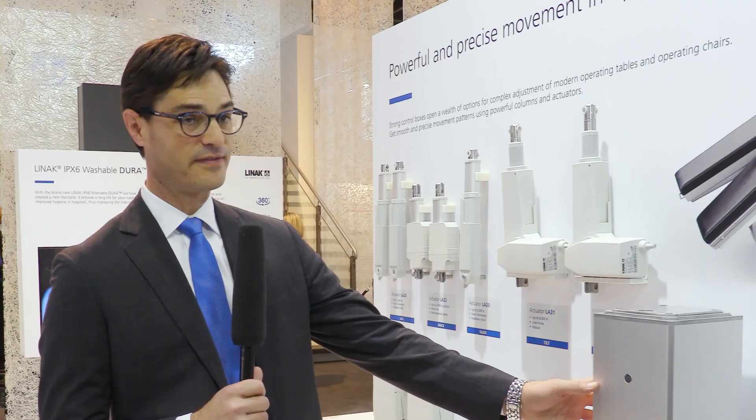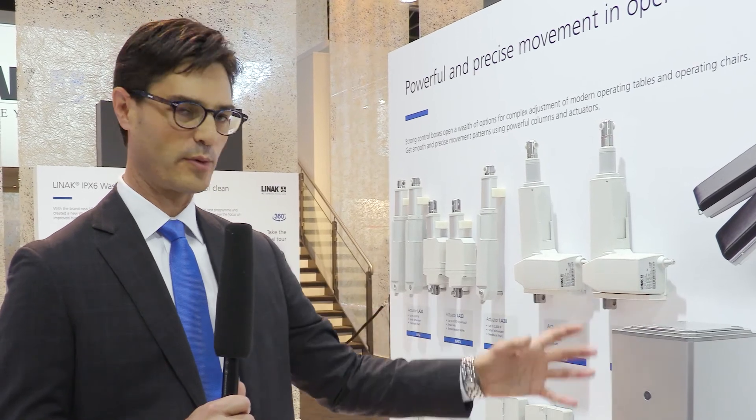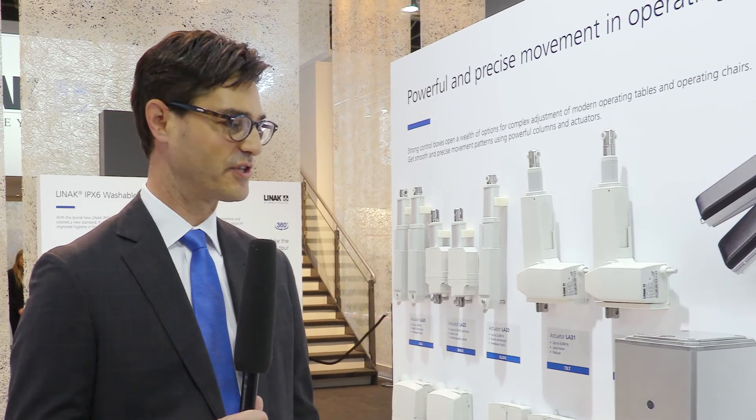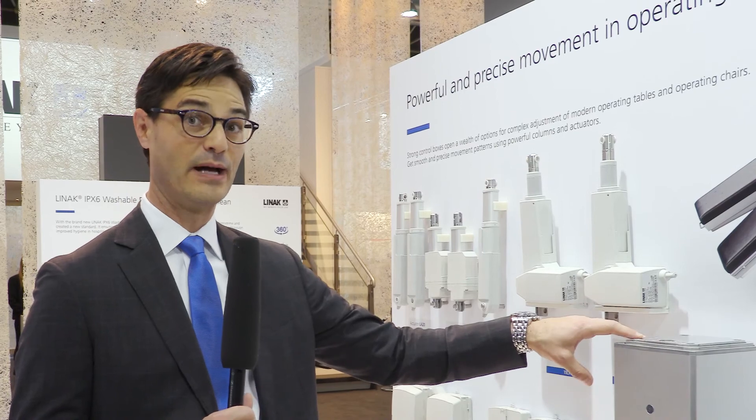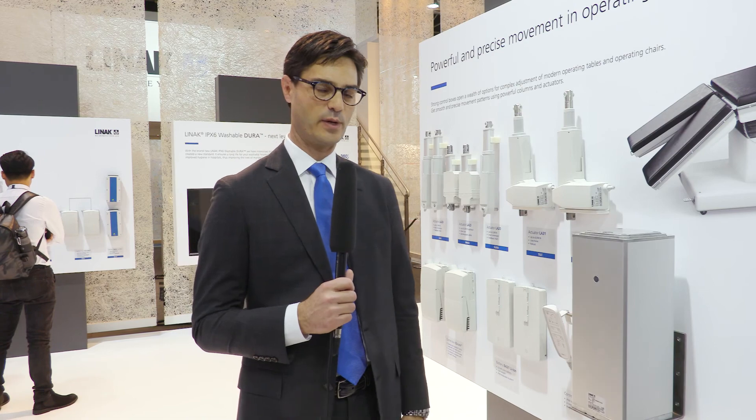An additional feature of the LC3 lifting column is a variety of very flexible cable-through options, where we're able to mount different cables through the column for additional mounting flexibility. You really don't see the cables and they don't interfere with the operation of the equipment.